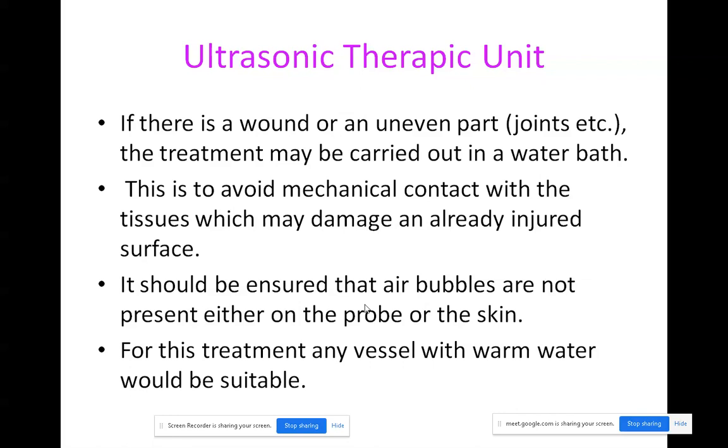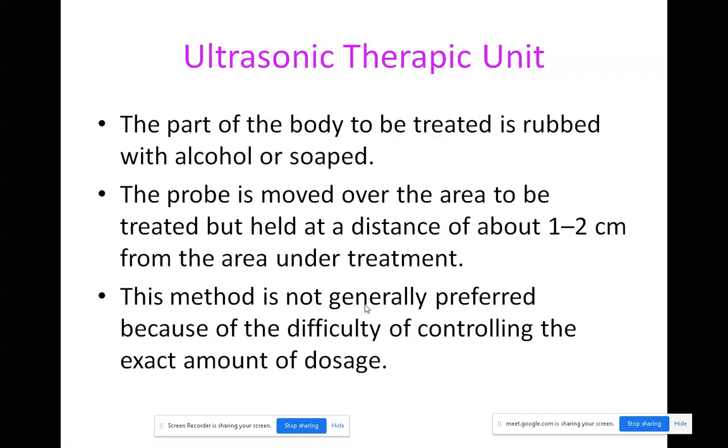It should be ensured that air bubbles are not present either on the probe or the skin. Air bubbles should not be there. For this treatment any vessel with warm water would be suitable. So you will be taking that water bath in warm water.